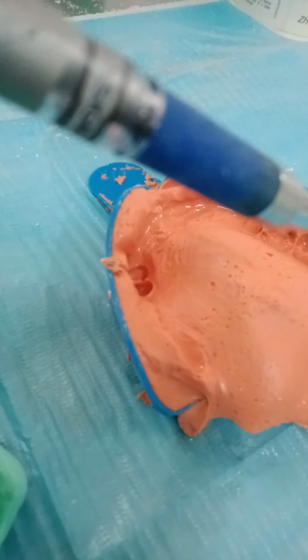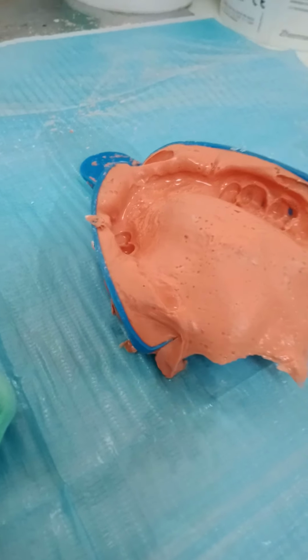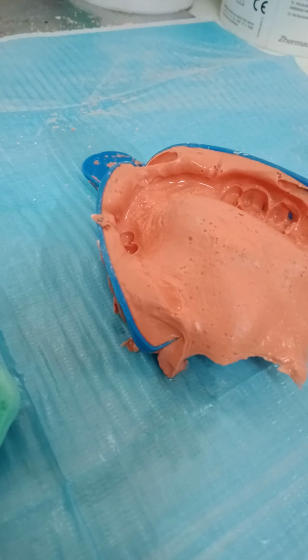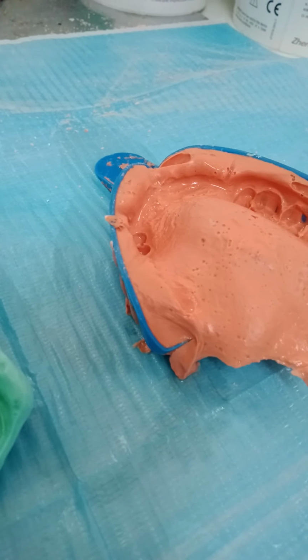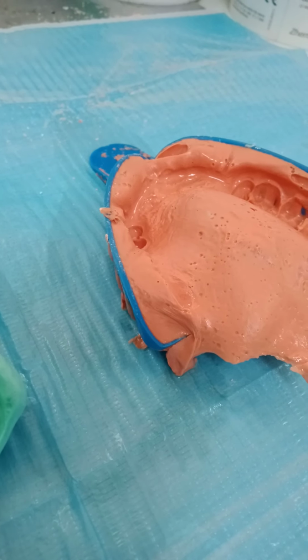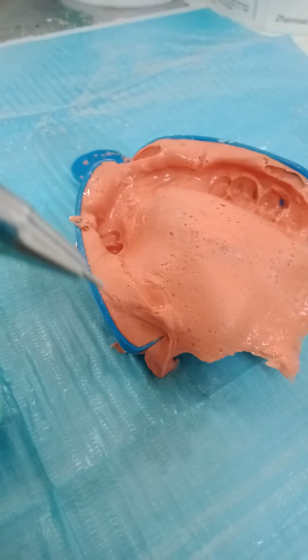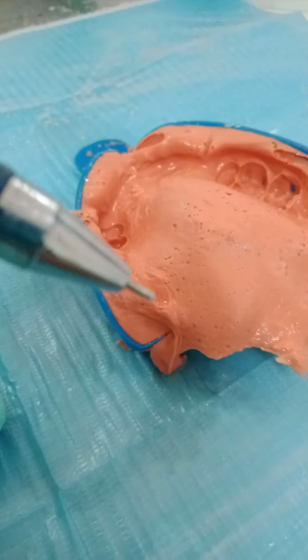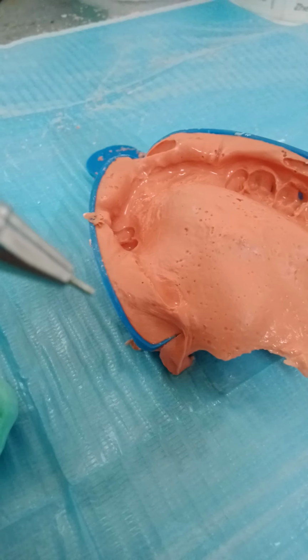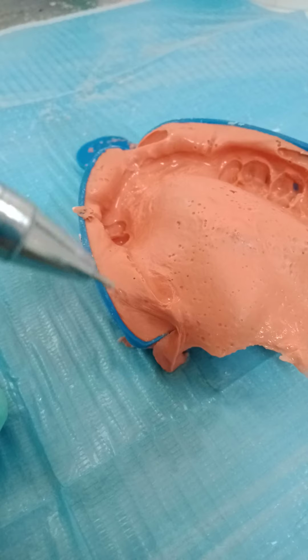I need posterior indirect retention in my design. Even if it's a transitional partial, I still need the same biomechanics. So it's not only for chrome cobalt. When I'm thinking about retention, I'm thinking about indirect retention and so on. In the acrylic, the good thing here is that I'm going to take the full depth and make a full post dam. I'm going to utilize this tuberosity area.